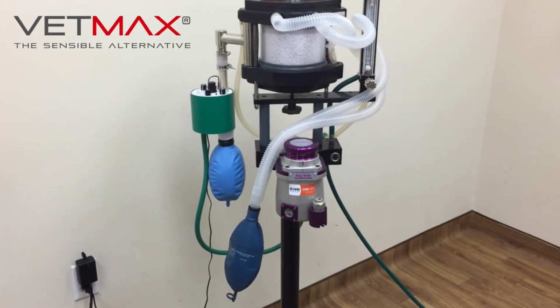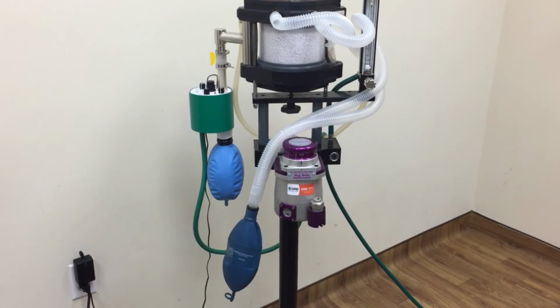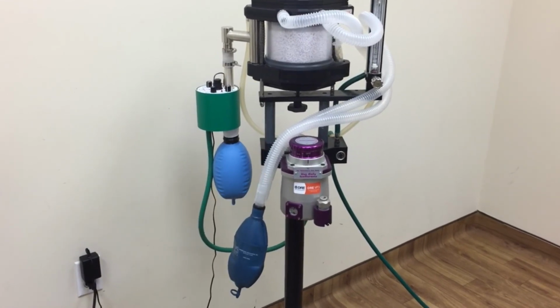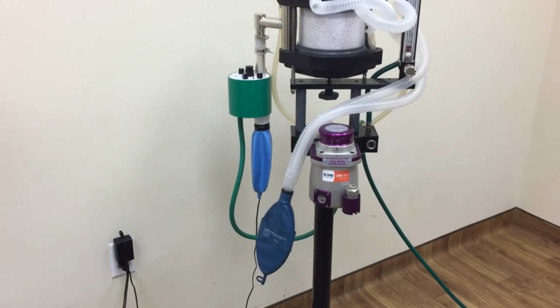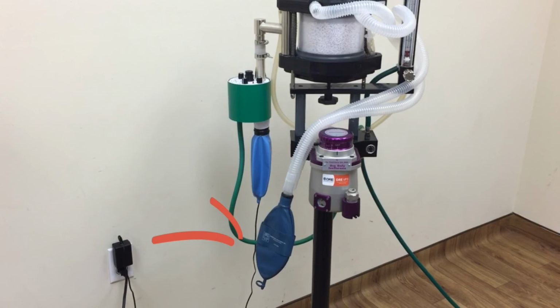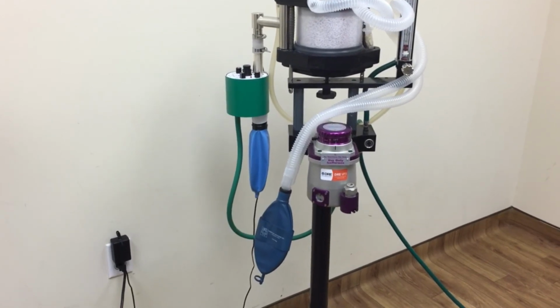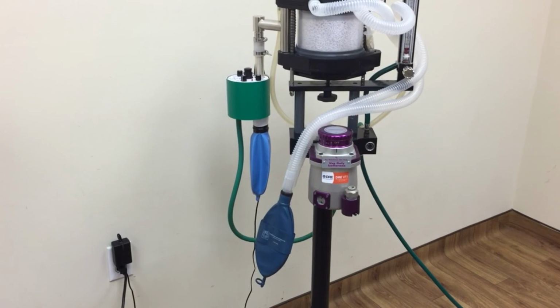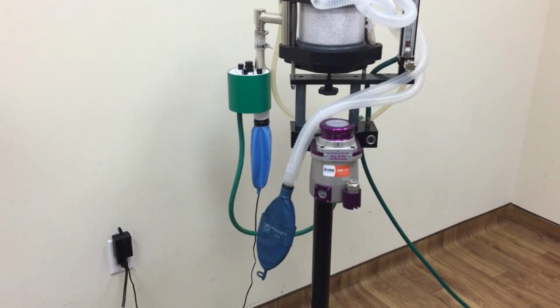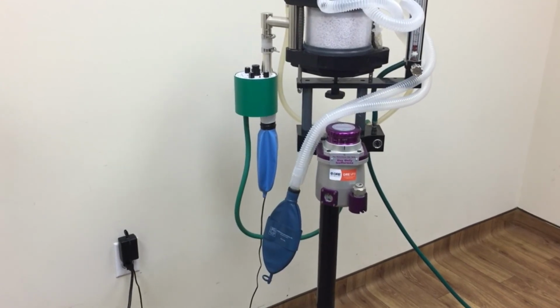Today we'll be demonstrating use of the Easy Breathe ventilator manufactured by Engler Engineering Corporation. For the purpose of this demonstration, we are using a test lung instead of a patient. The test lung is similar to a reservoir bag, except that it has certain internal structures and banding to make it act more like a real lung.